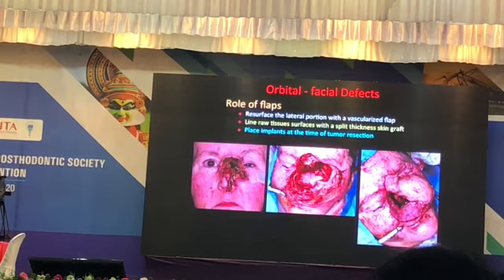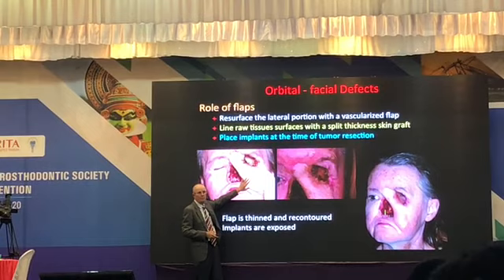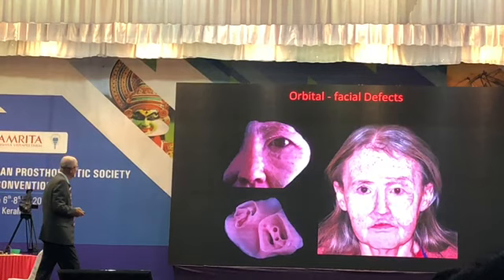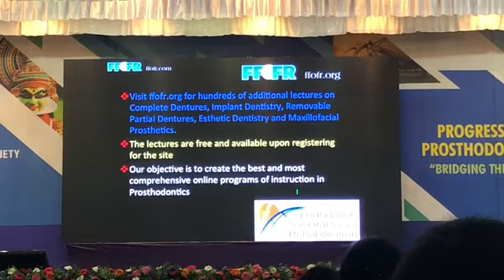So you put the implants in at the time of tumor resection. I showed you this case before. The flaps sometimes need to be debulked. So this flap is too bulbous, so this part is debulked to create space for the orbital appliance. This is one of Dr. Giannetti's cases. Here's the implants and the finished appliance. So you have a chance of really doing some pretty significant things with implants and big facial prostheses. So, we are finished, and I am ready to answer any questions you might have.